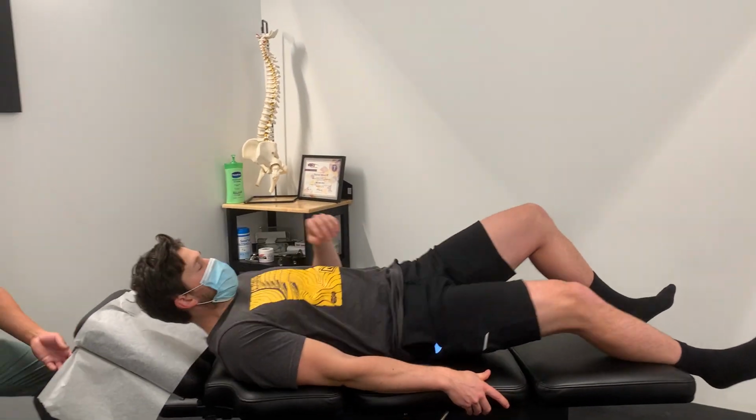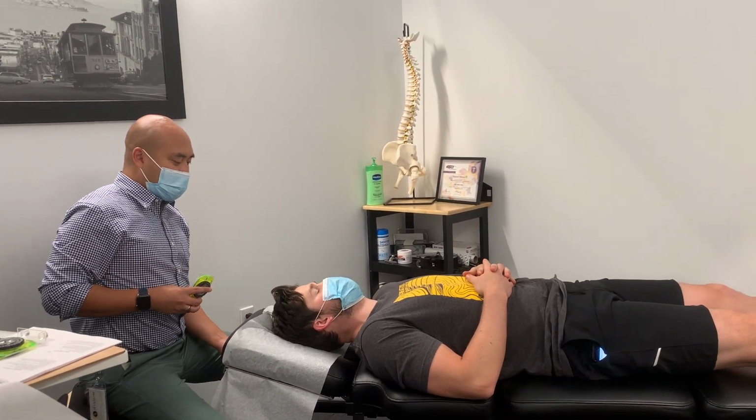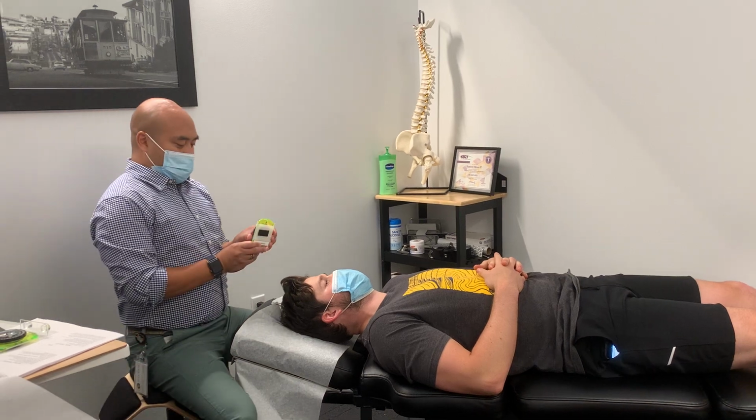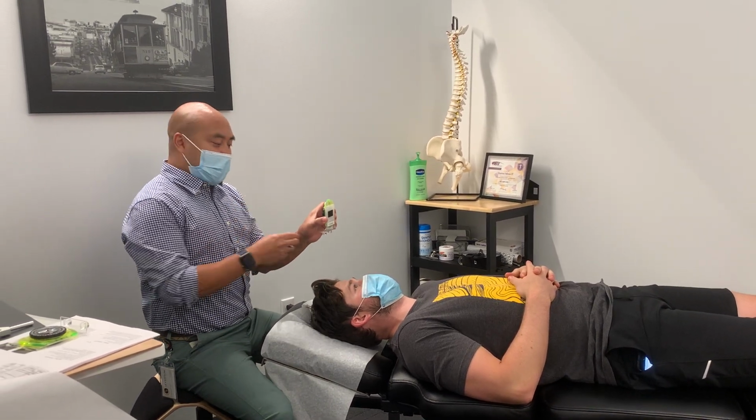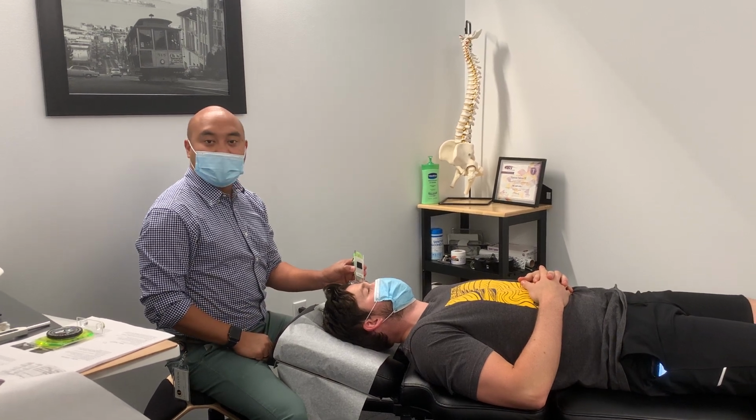And again, with cervical rotation, we're only going to use 1 inclinometer. I'll lower the headpiece just a little bit for patient comfort. So we'll place the inclinometer facing me, and I'm going to zero it out. I'm going to place it above the eyebrow of the side that I'm not testing.